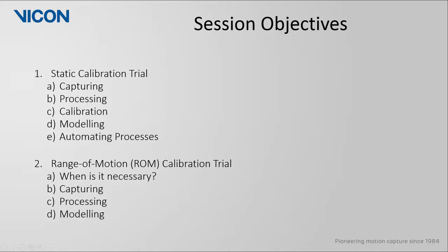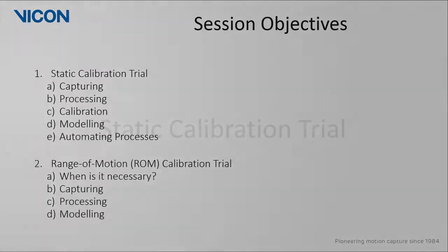For the ROM trial, we will first discuss when such a trial may be necessary, and then how to go about capturing and processing this trial. We will then look at how to model after calibrating the template.